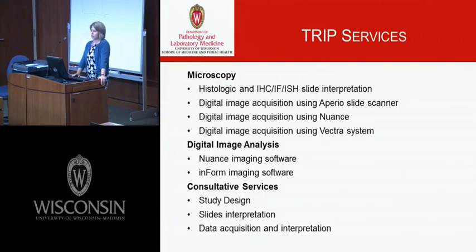Moving on to microscopy, we can provide histologic and then immunohistochemical, immunofluorescence, in situ slide interpretation. We can provide you with digital images using the Aperio slide scanner. These images can be acquired using the NUANCE system, which I will speak about briefly. Also, these images can be acquired using an automated Vectra system.